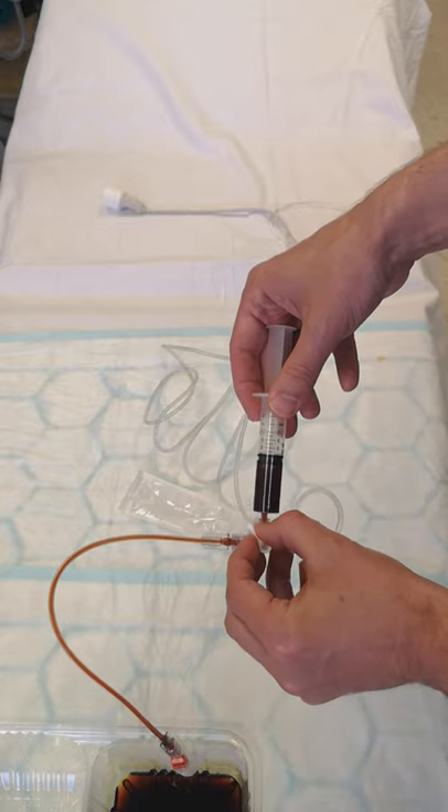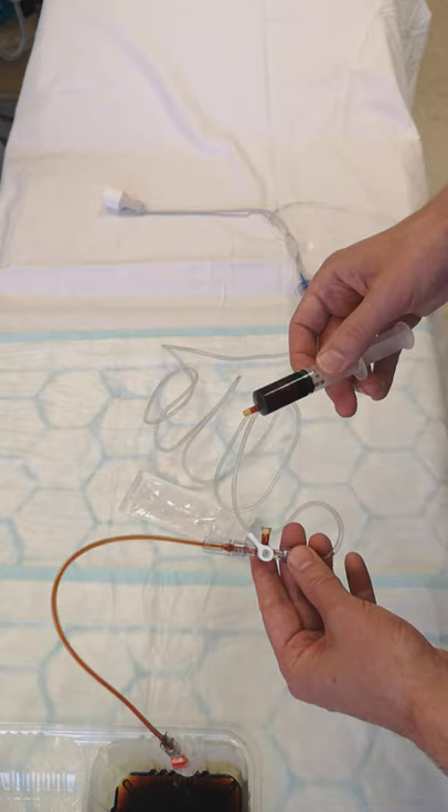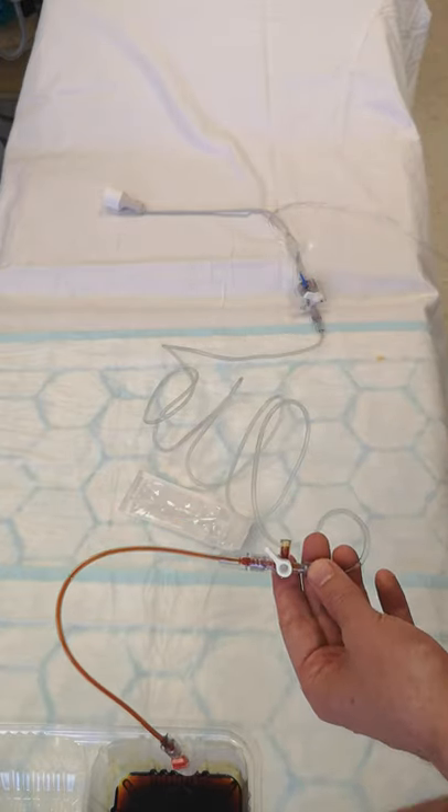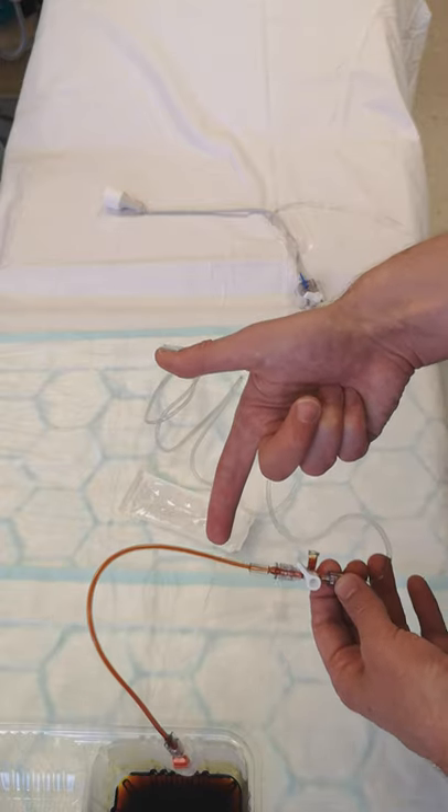A good thing to note with these valves: if you put the handle diagonally, it will be off to all ports simultaneously. So that's another option. Now that we've got the sample, we can't leave blood sitting in the tubing — we need to flush it out.